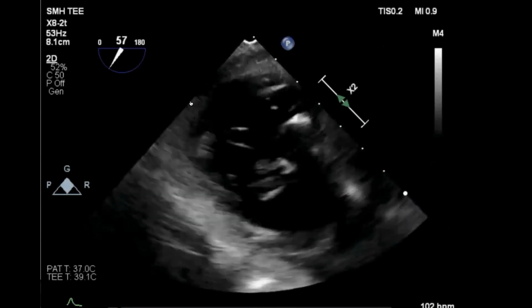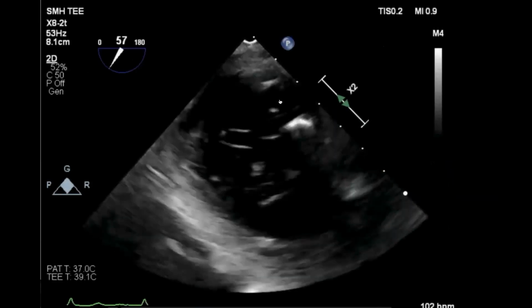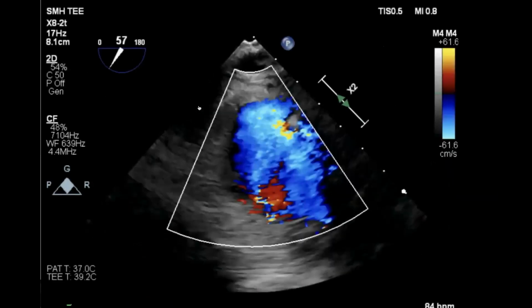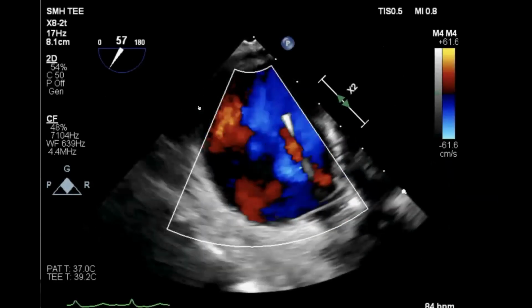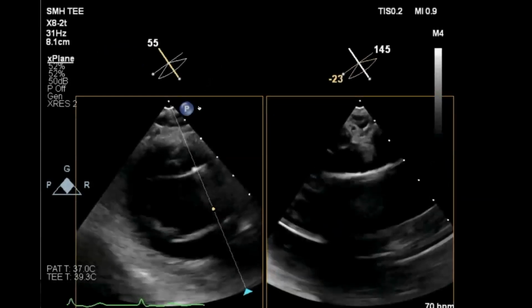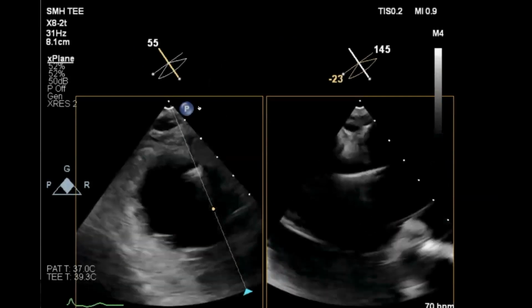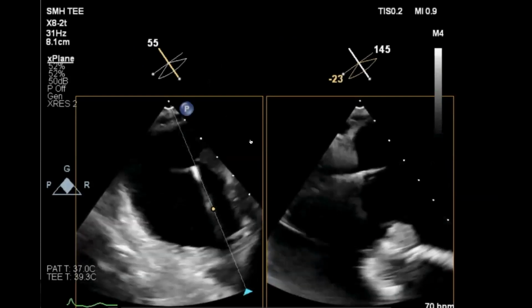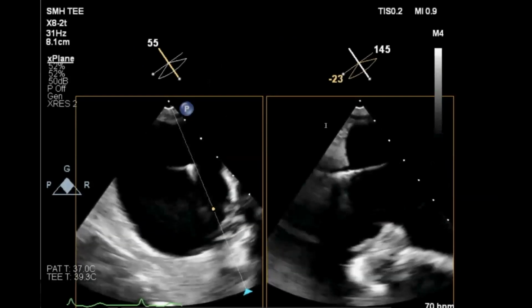Second of all, the lead is indeed tucked into the posterior septal commissure there. There's a large central coaptation gap, and you can see tons and tons of TR. When we echo directly through the lead, we again don't really see it. It's tough to see a lot of things in this view, but we don't obviously see impingement.